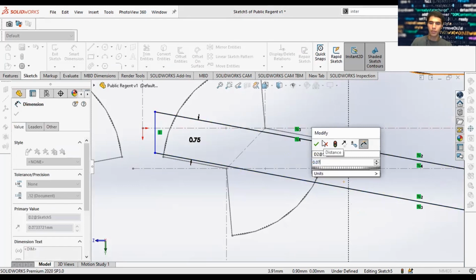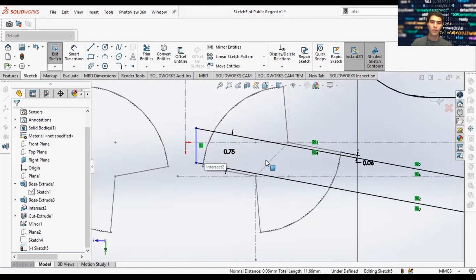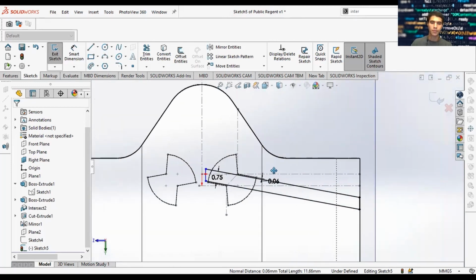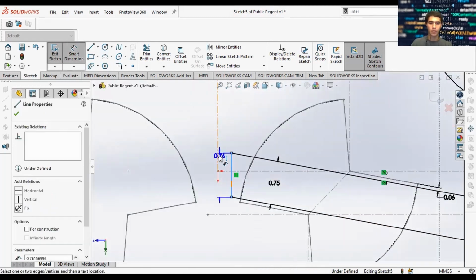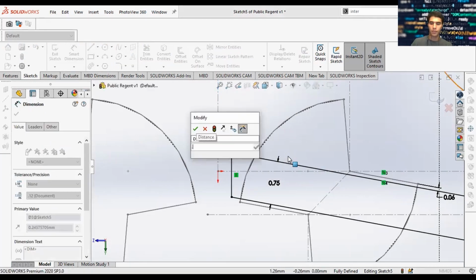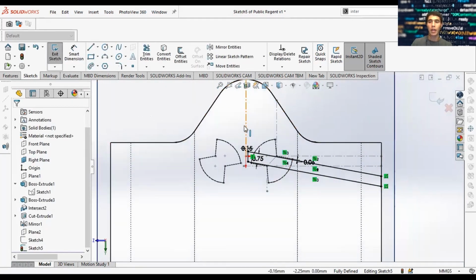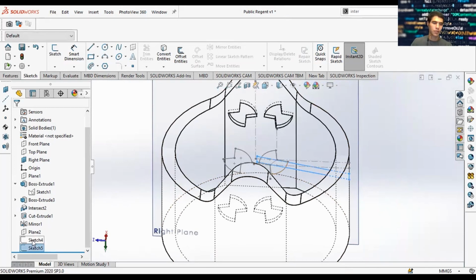So we're at 0.06. And this would be more or less 0.06. Yes. So now we know it's centered to our hinge. And coincident here by the wall of the mechanical valve. So what I'm going to do here is give some distance to this reference line, and now it's fully defined. There's sketch number 5.